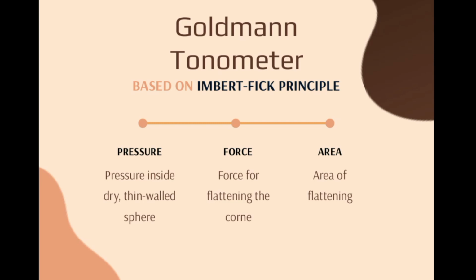In physics you have learned that pressure equals force per area. So that is the Imbert-Fick law, which has a focus on 3 factors, of which one is pressure, which is inside the sphere, right? Over here we are considering the sphere as a cornea. So the pressure inside the cornea, right?